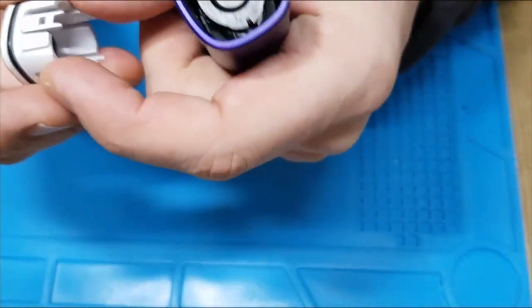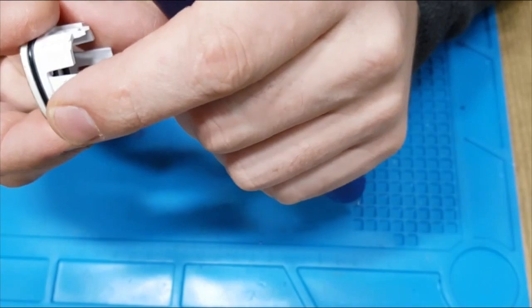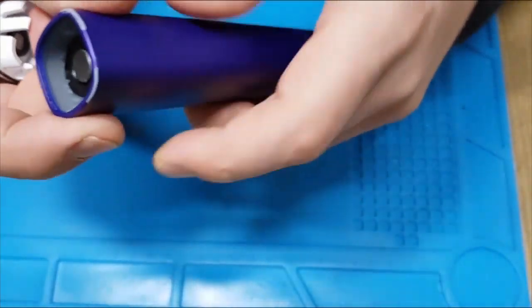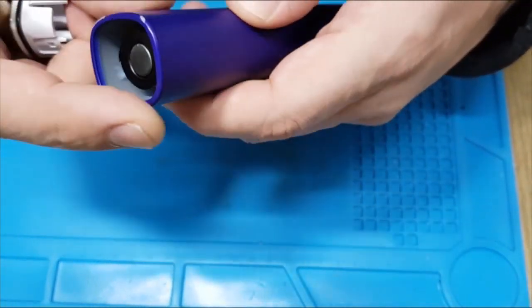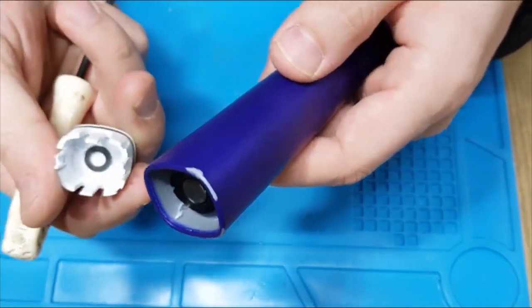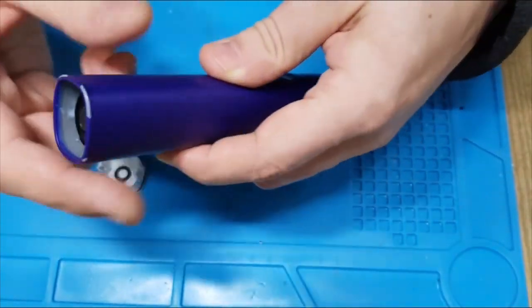As you can see, it has some clips that hold it in place. And this is the method that I found is non-intrusive. These damages were already there before taking it apart, and you can, without damaging, take off the cover and repair the toothbrush. So that's it.